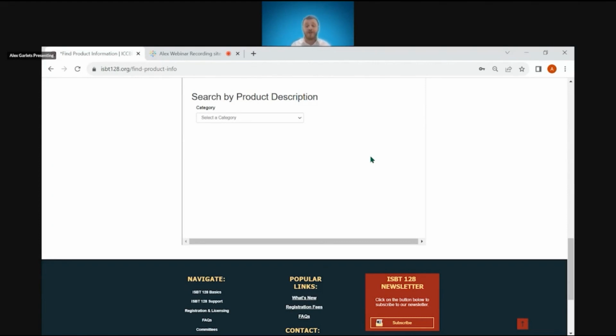So in order to discover if there is a PDC that fits that description, we simply need to build our product description, and this lookup tool will provide us with any PDCs that potentially fit what we are looking for. So for this one, I'm going to use a CAR T cells product description for my example, and I'm going to be building this product description to my predetermined level of granularity that I want to describe this product.